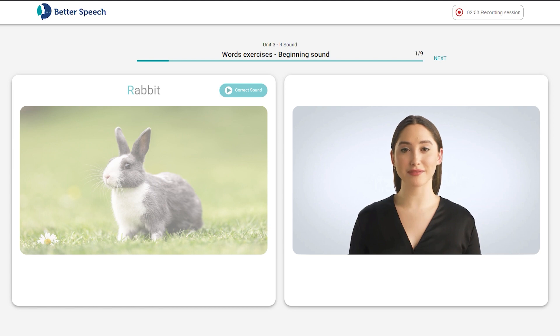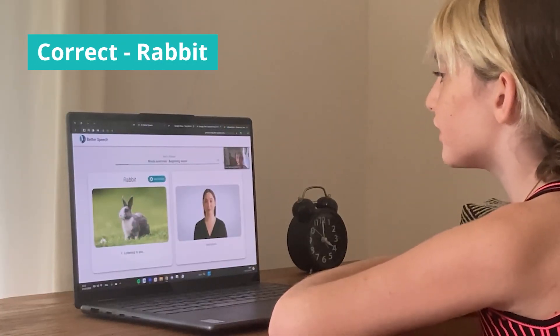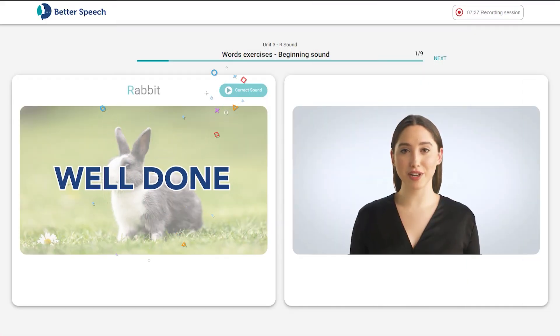Nice try. Our tongue needs to be tight, up, and back for our R to sound right. Let's say it again. Rabbit, rabbit, rabbit. Your R sounds clear. Nice job keeping your lips in a small smile. Keep going.